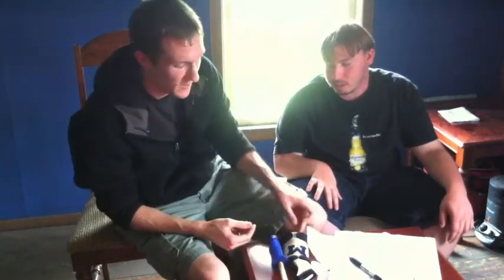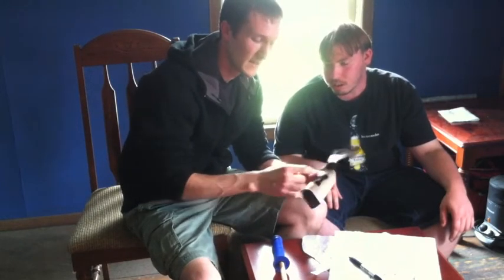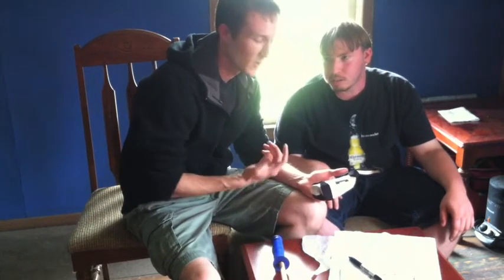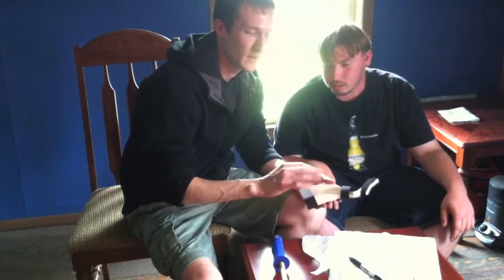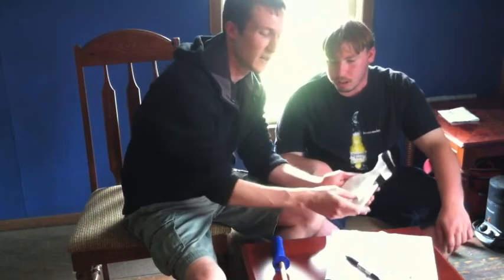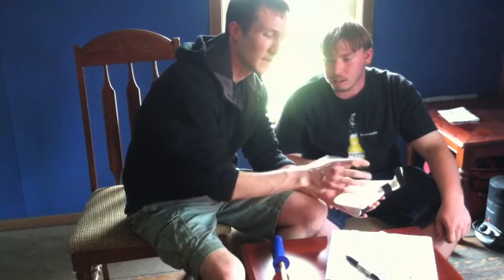So after we have this cut out, we take our splinting material. The particular type of material I used, I borrowed from Grand Valley State, and it's a pretty durable, hard material that can be formed when it's heated up on the stove with some water. This was used scrap material, so I actually had to heat it up, flatten it out, and let it harden. Then we traced this design on the actual splinting material in wax crayon, because when we dip it back in the water and heat it back up, the wax crayon will stay on there.